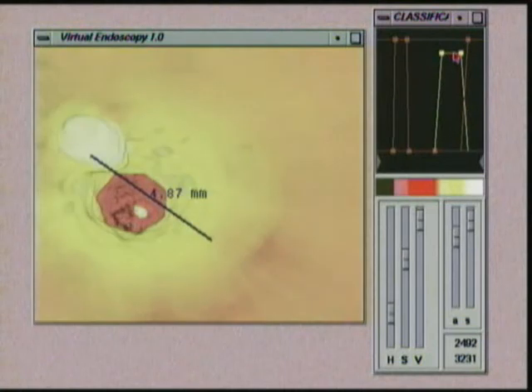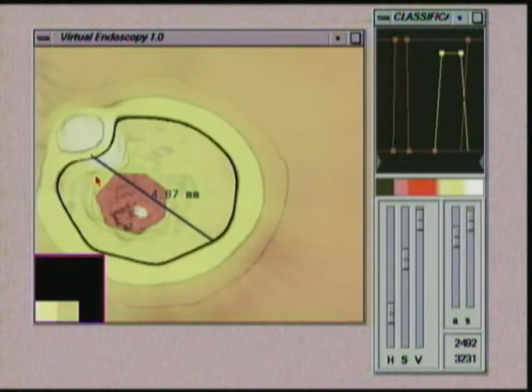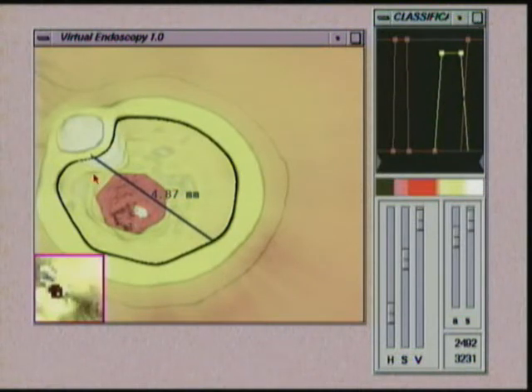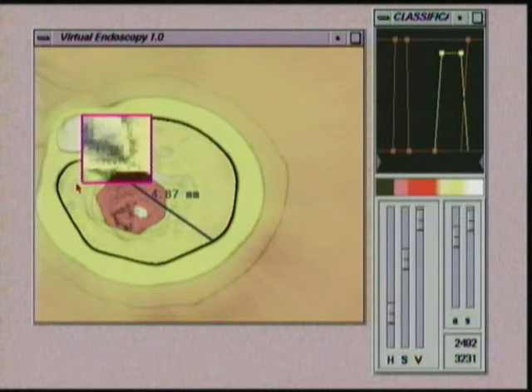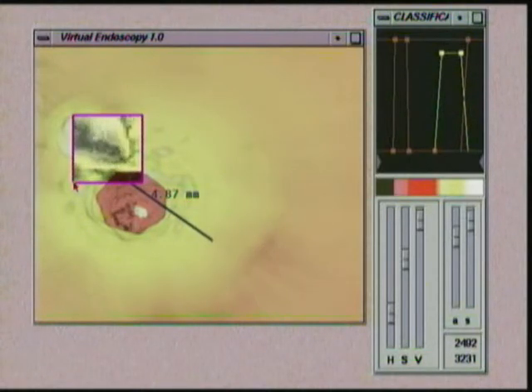To obtain an accurate visualization beyond the capabilities of the real-time volume renderer, we activate a viewing filter that produces a ray-casted view of a screen region attached to the 2D cursor.